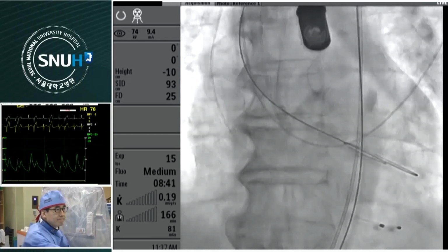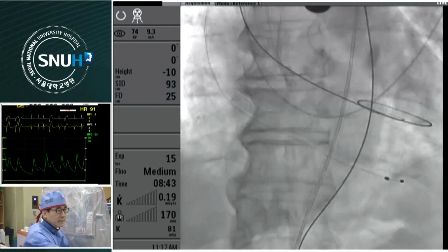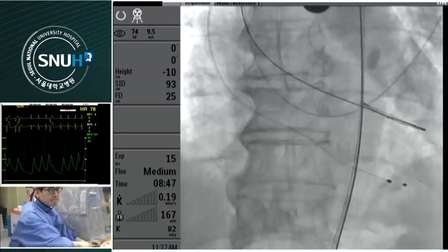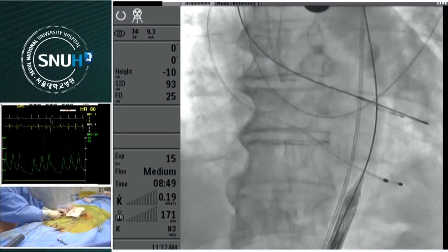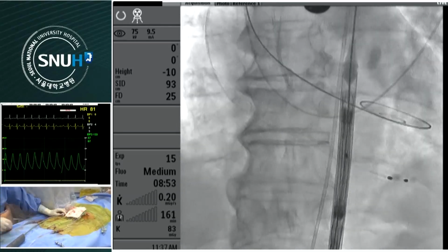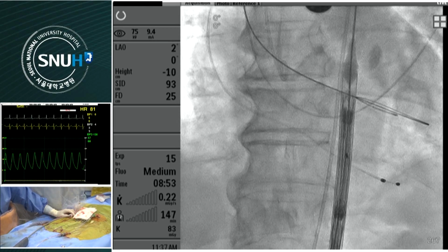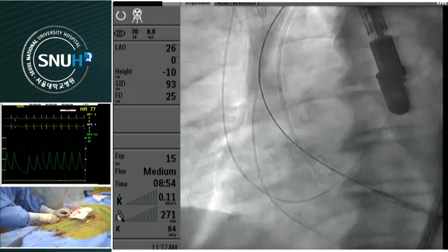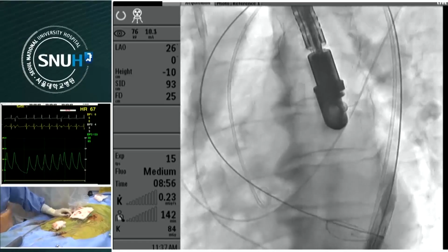And there is a question from the audience. Okay. 16 millimeters for the left, and 10 for the right. Yeah, 10 millimeters. Use a microphone.